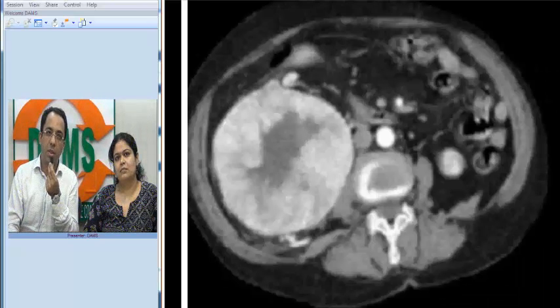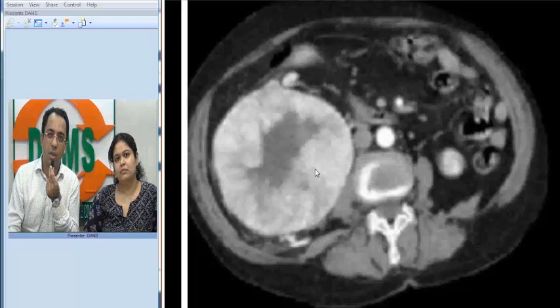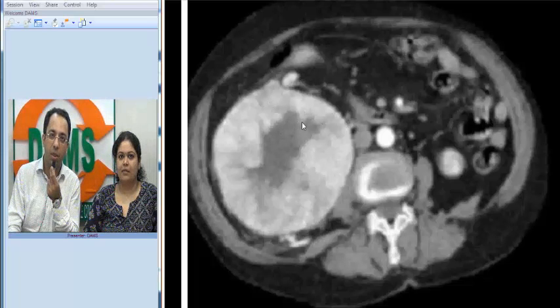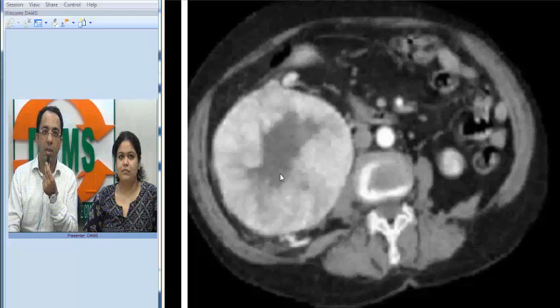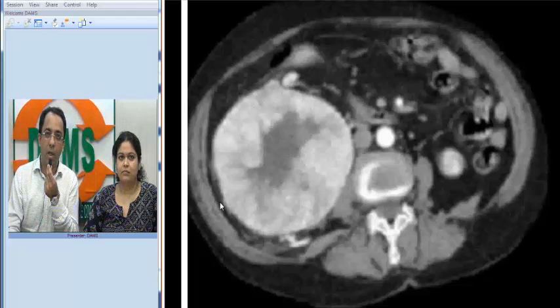This is the contrast-enhanced image of the same patient. With intravenous dye, you can see the aorta and the kidney enhancing. We are in the arterial phase. The tumor is homogeneously enhancing, but the central part is non-enhancing. The patient has a central non-enhancing scar in a stellate pattern — this is a large lesion.